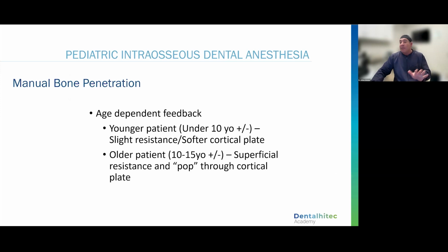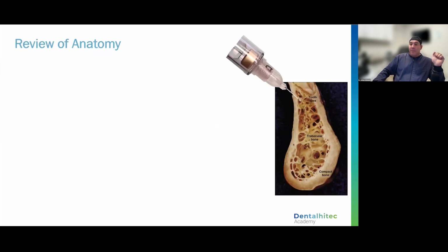Some people worry that they don't hear the pop. Just because you don't feel a pop or hear a pop doesn't mean that you're not past the cortical plate. I will tell you that 10 and under, you may not even feel much resistance because the plate is so thin. 10 and above, you're usually going to feel a pop there.